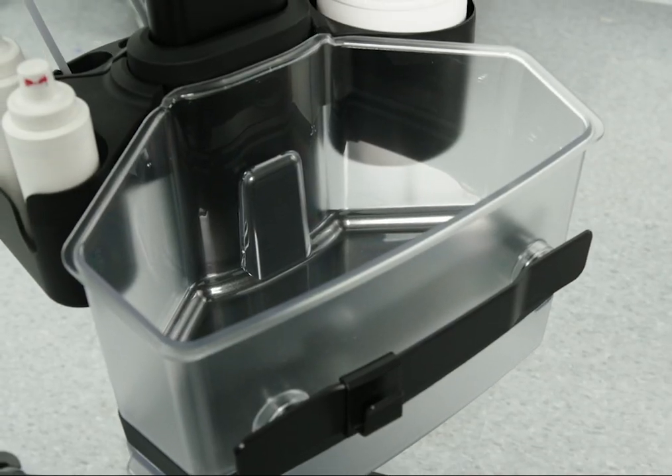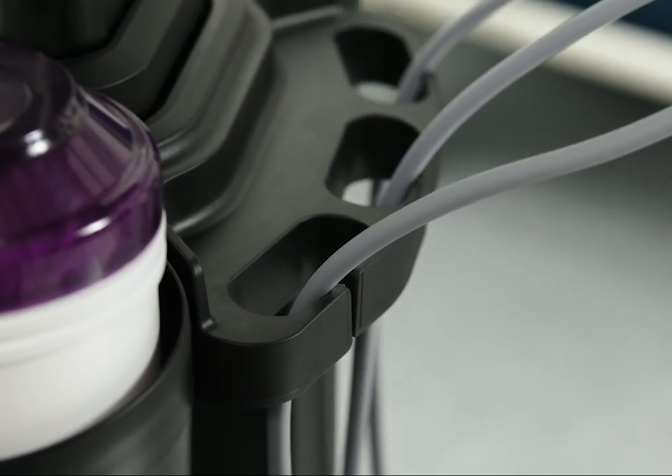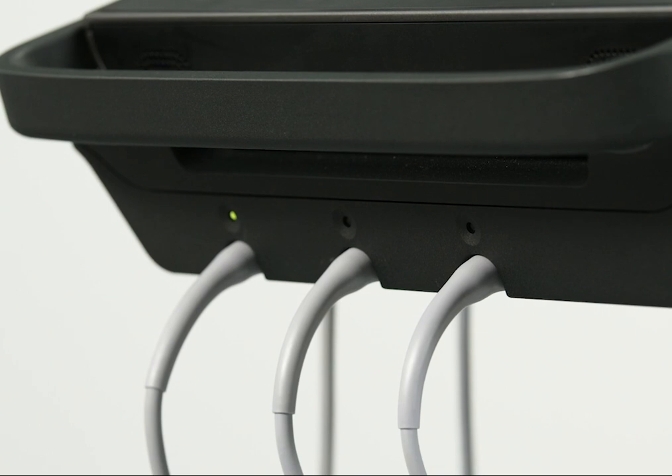The full-featured stand gives you everything you need at your fingertips, including storage, gel and wipe holders, cable management, and a built-in triple transducer connector or TTC, which allows you to install up to three transducers.